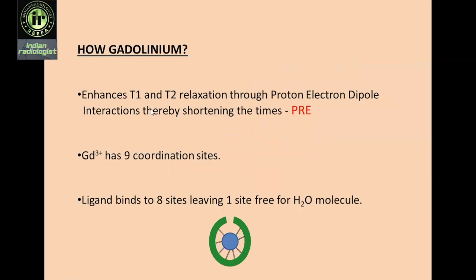Gadolinium actually enhances both T1 and T2 relaxations, and the main mechanism behind it is proton electron dipole interaction. It's not complicated; the name is self-explanatory. Proton, the tissue that we are dealing with, conserve the water protons, and electrons, because gadolinium has 7 unpaired electrons. Dipole is nothing but two poles. Any field that has two poles is called a dipole.